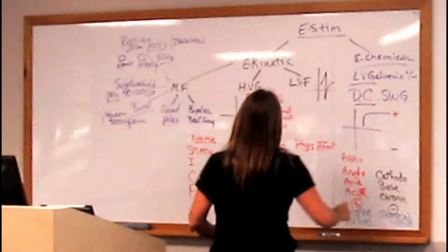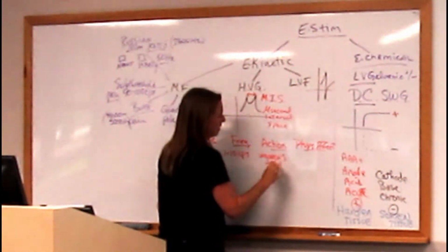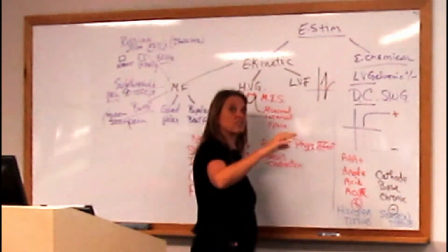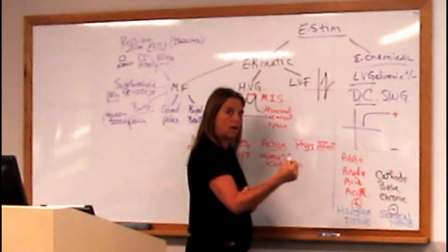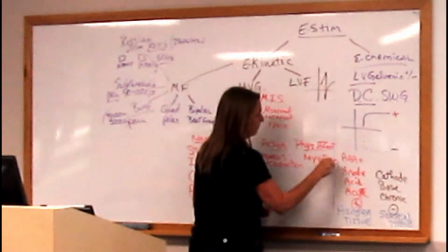So in that case, I'm going to say that this is going to be a vigorous contraction, but it's not to the point of tetany, which means the contraction goes into moving the muscle. So it's a vigorous contraction. It looks like a shimmer in the muscles, or if you do it slowly, you can actually get a kind of a beat, and you can count the number of cycles per second. And this is for breaking up myofascial adhesions.